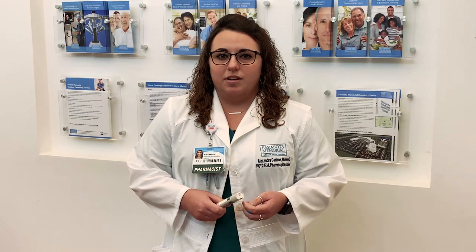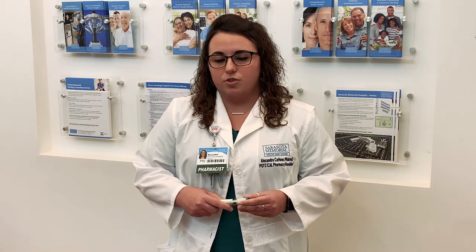And when you are done, make sure you call 911 or seek medical care immediately, because if you do use your epinephrine pen, it is a life-threatening emergency and you need medical care right away.